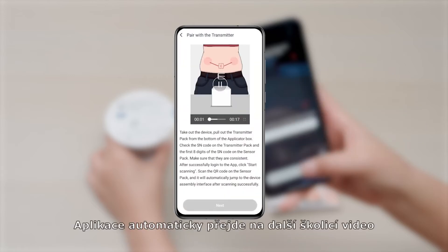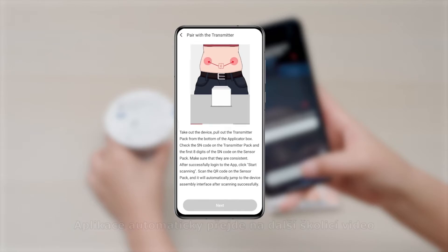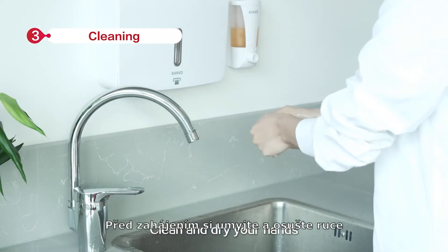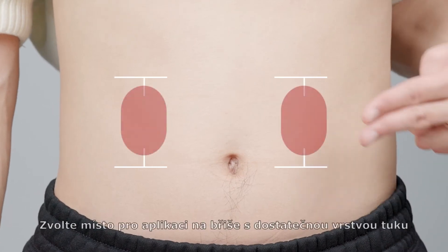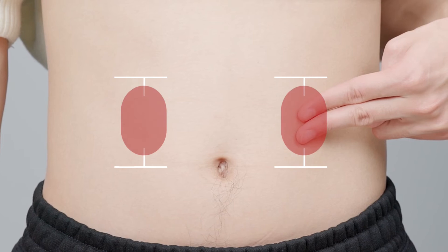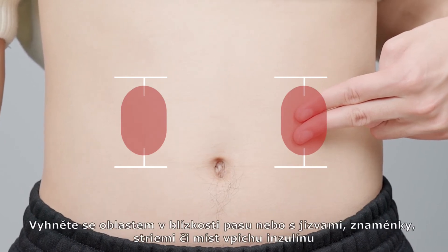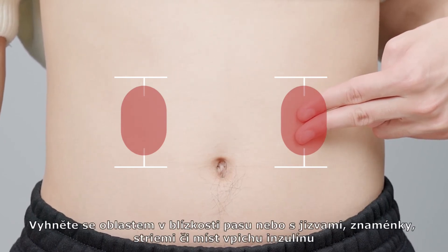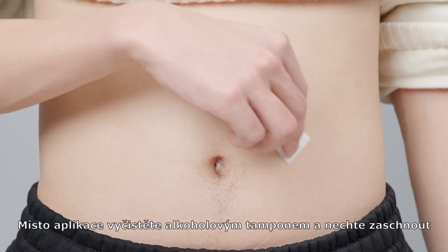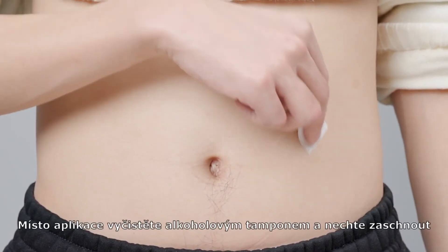The app will automatically jump to the next training video. Before you begin, clean and dry your hands. Choose an insertion site on the abdomen with enough fat. Avoid areas near bends or with scars, moles, stretch marks, lumps, and insulin injection sites. Clean your site with an alcohol pad and let it dry.